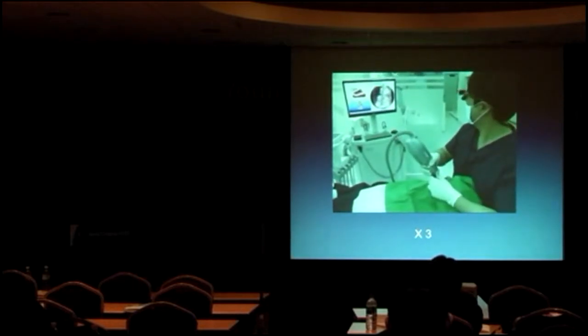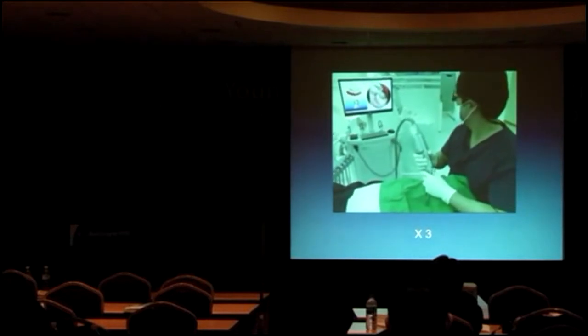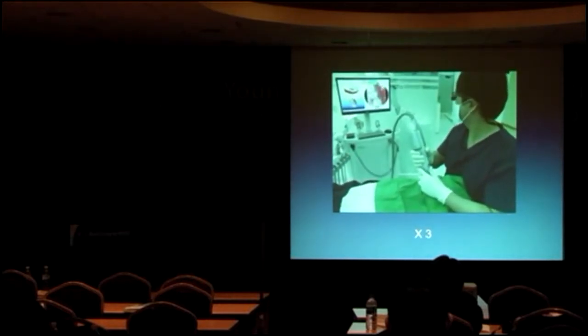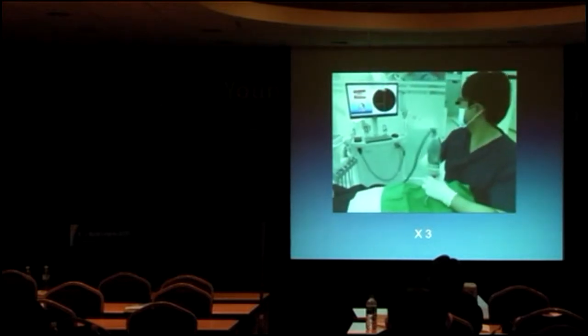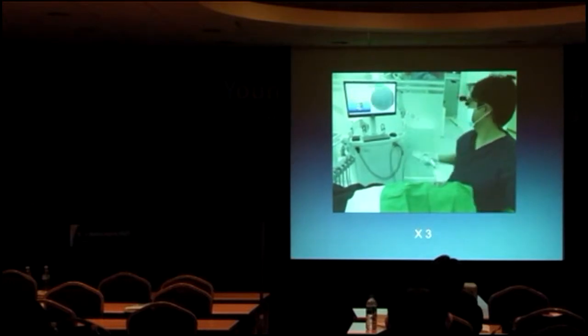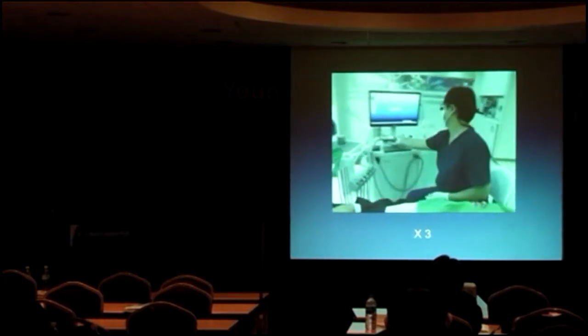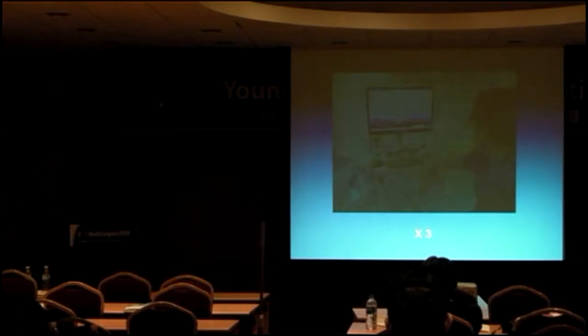So I took the upper already, and for the lower, I'm taking the antagonist. So this is actually taking the bite. Only a few pictures of the bite can give you an occlusal registration, a bite registration. After a few seconds, you can see the virtual model on the screen right next to it. So it's very easy and precise to check how good the impression is.